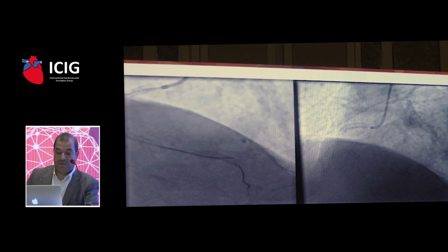I mean, part of the stent was cut and is lodged proximally, and another part is lodged distally. Absolutely. And you can compare the first images when I start placing my stent to the subsequent images that will show that this is a complete fracture of the stent.